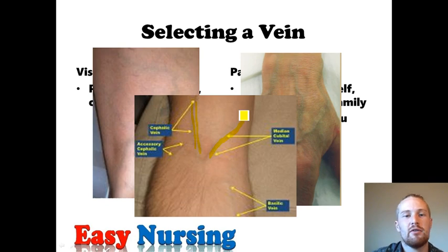It's a little bit different if you're doing surgery or ER, in which case you just want to get an IV quick, and typically those patients you want to get a big fat 20 gauge or 18 gauge IV in here. So it depends on what kind of IV you're wanting to start. Me personally, being a med-surg nurse, I avoid anything in the AC or the hands.